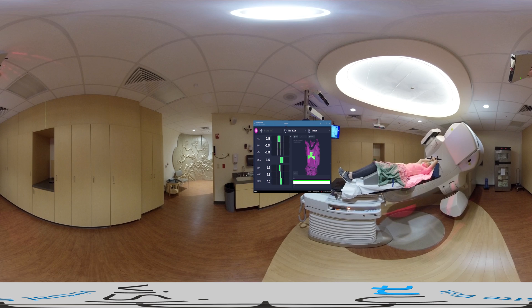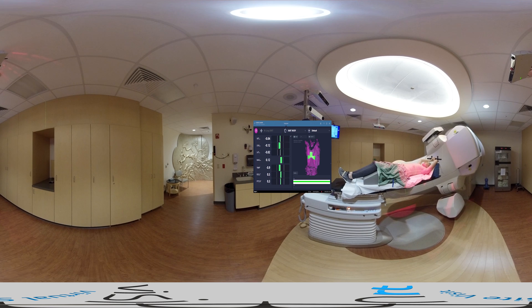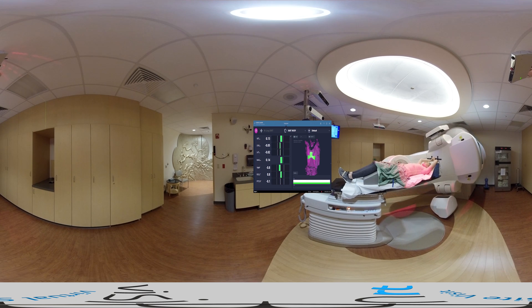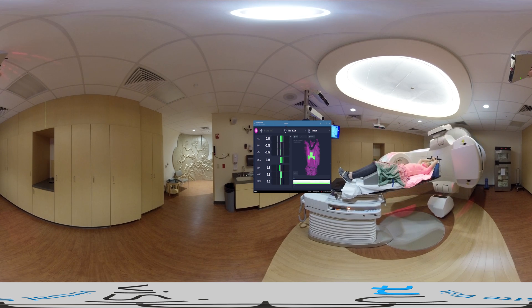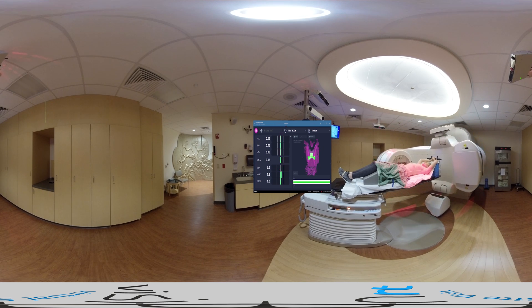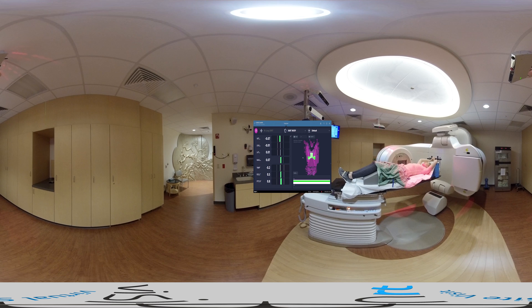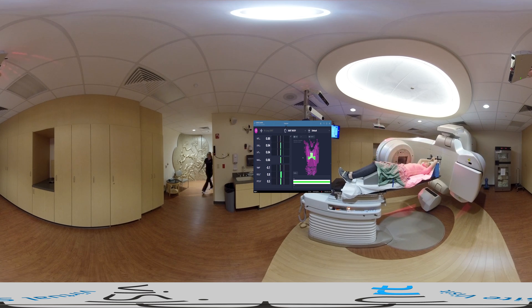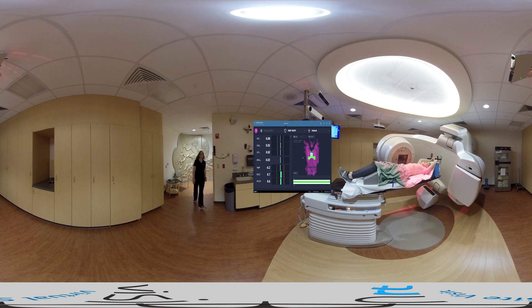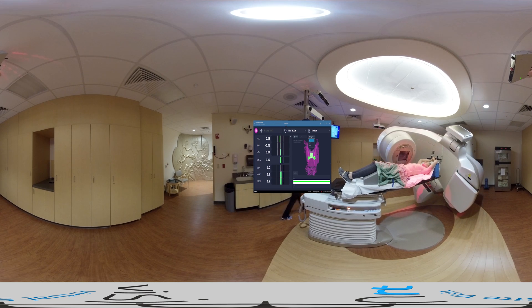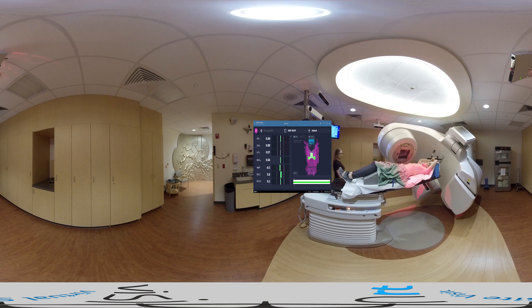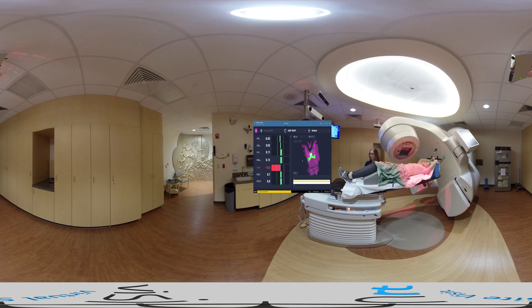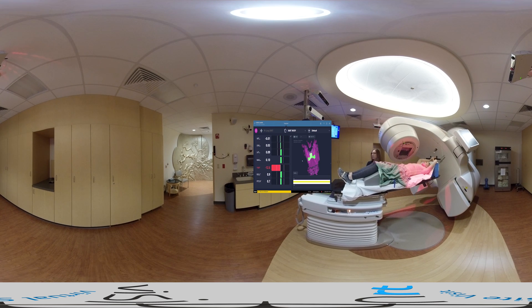Sometimes couch rotations are included in the treatment plan. For these cases, a new reference surface is not needed for each rotation. We can easily rotate the reference surface position in AlignRT to the correct position, rotate the couch, and continue treating.